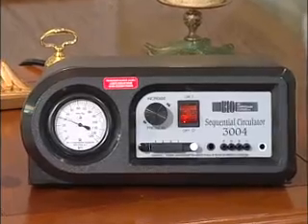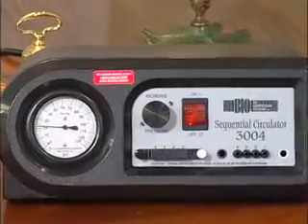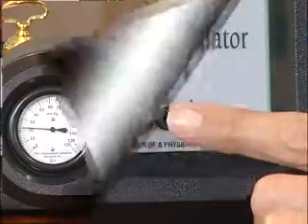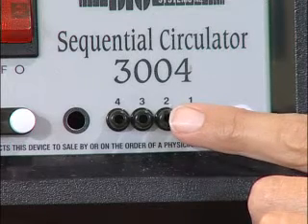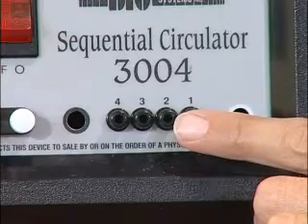Note that you may need to repeat this step several times since the cycle for chamber number 1 only lasts a few seconds, and the pressure adjustment should only be made using port number 1. If you are uncertain, use your finger to feel the air coming out of port number 1. Totally cover it and proceed only while pressure exists in port number 1.